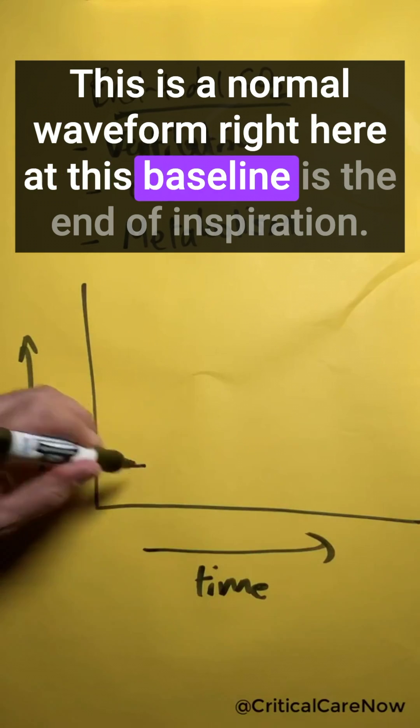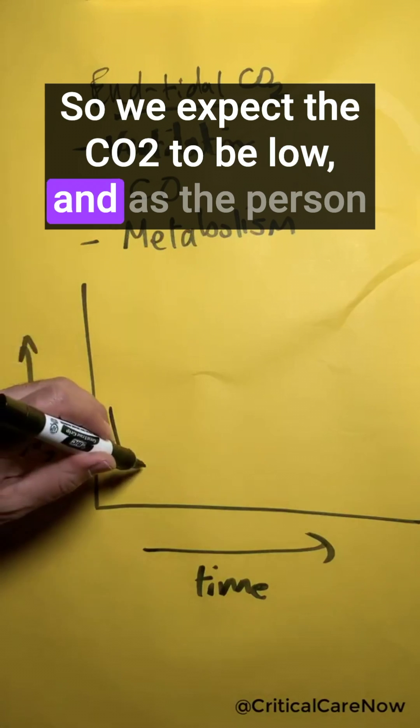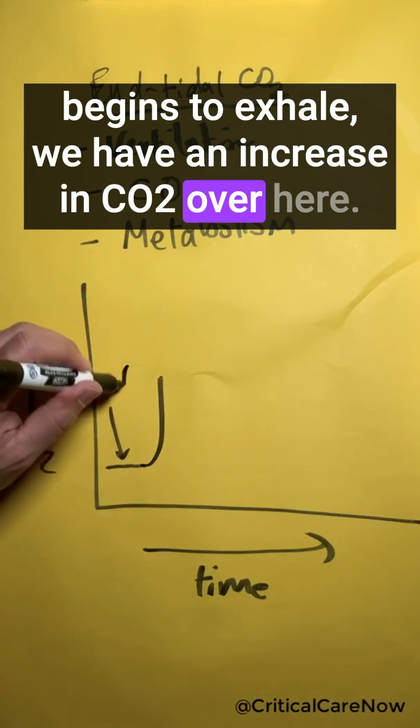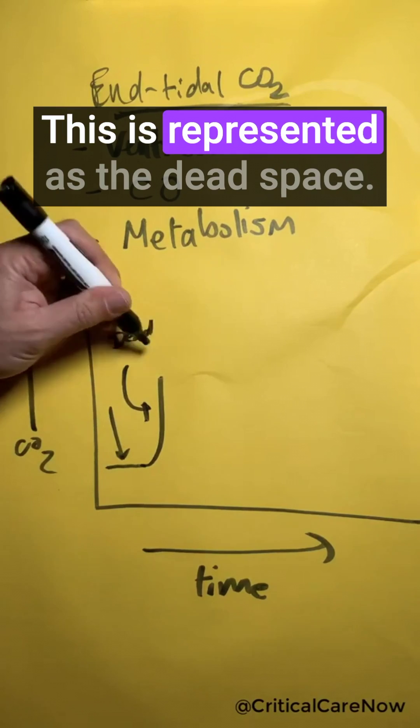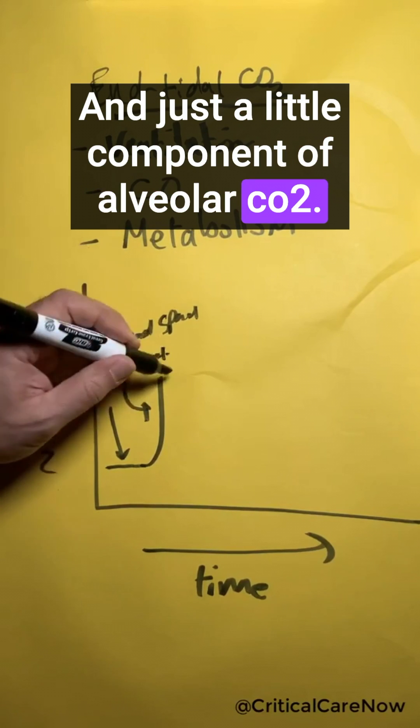Right here at this baseline is the end of inspiration, so we expect the CO2 to be low. And as the person begins to exhale, we have an increase in CO2 over here. This is represented as the dead space and just a little component of alveolar CO2.